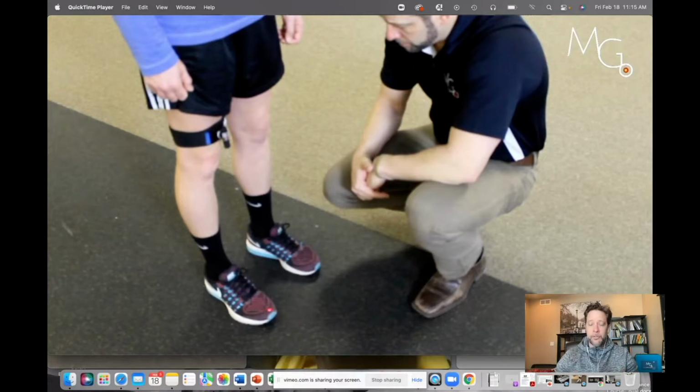It's going to have to occur from the knee going into extension, so therefore you're going to have to get knee motion via quad activity. You can't substitute that otherwise. So a patient is going to maybe be working very hard, and they won't be moving that laser at all. And that's going to be a very good recognition moment for the patient and for yourself about how they're able to perform this task. So you can't substitute anymore for your patient being inefficient.